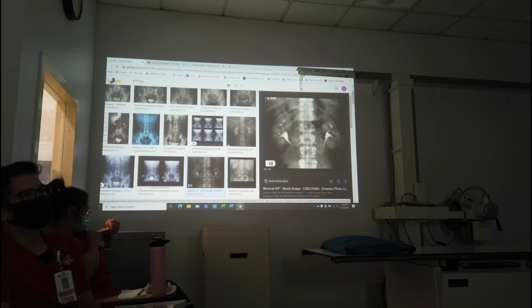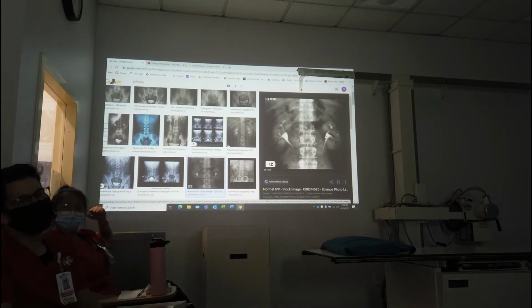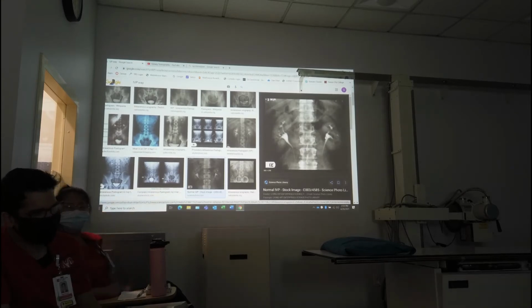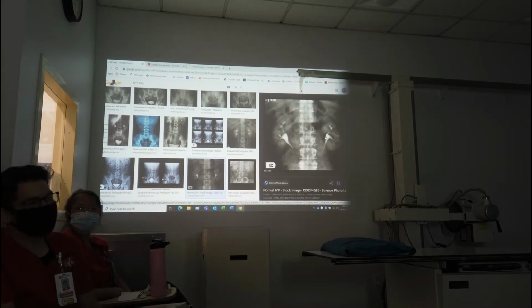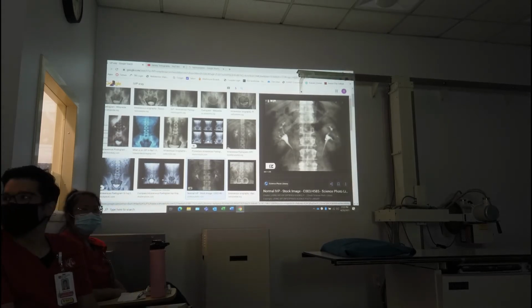You said it happened to you. They knew the patient had already coded earlier, but the doctor wanted a CT with contrast, and he said do it anyways. So we put the patient in the machine, gave him the contrast, and when he came out the machine, the nurse said, what does the monitor say? Flat line. So we went in there, we started CPR, and then they called the code overhead, and the ED came and took the patient on. It happens. That was the second time.